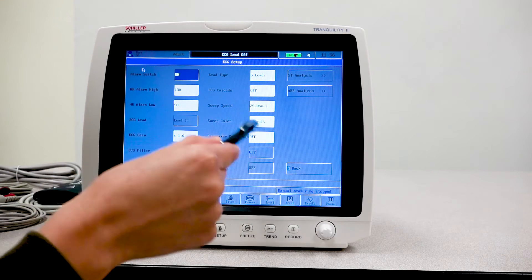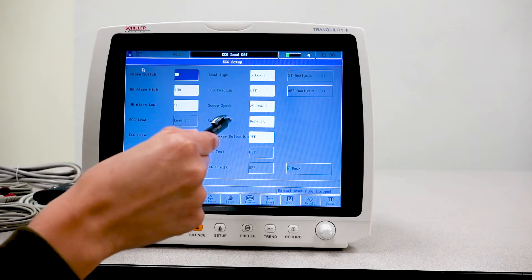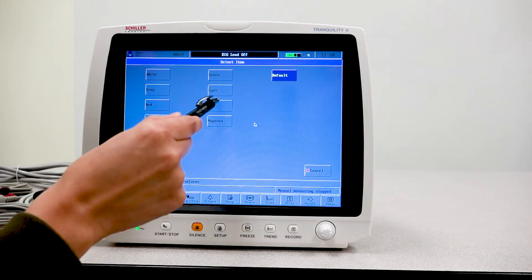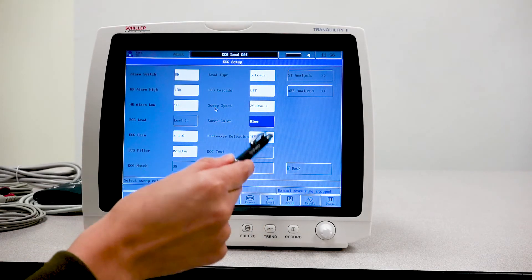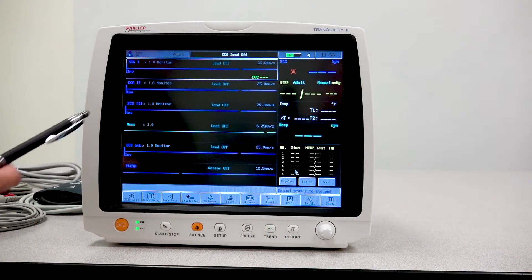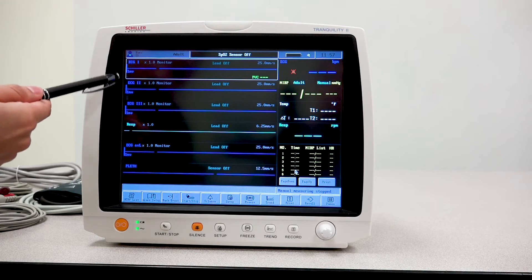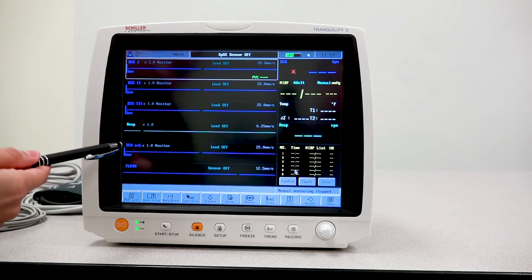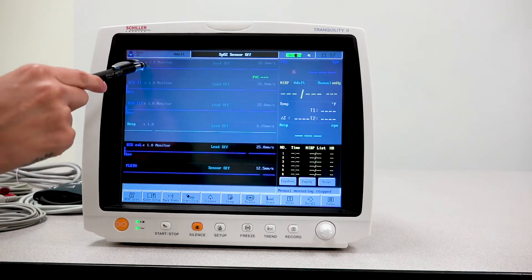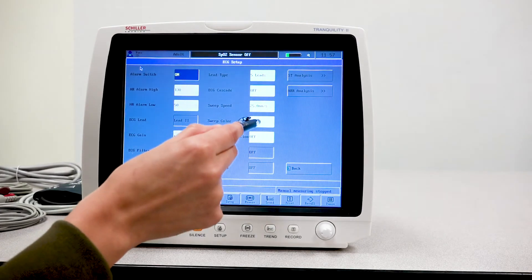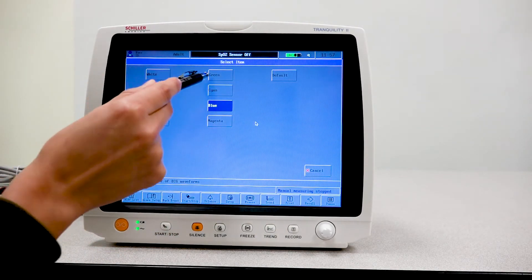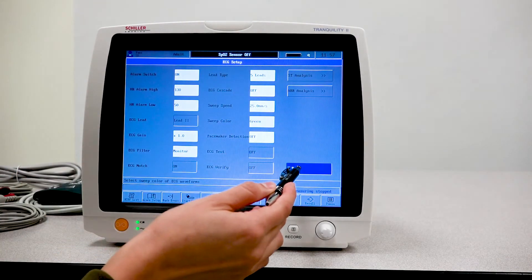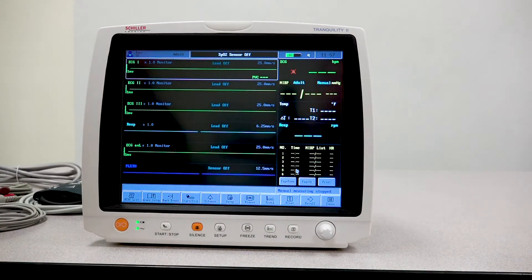Here is where I would actually select the 3-lead or 5-lead patient cable, whether or not I want the unit to detect the pacemaker. And then you also have the ability to change the color of the waveform. For example, that was green. If I want to change it to blue, if I go ahead and press back, you will notice that all of my ECG waveforms have changed. Let's go back for the sake of the video and change it back to green.